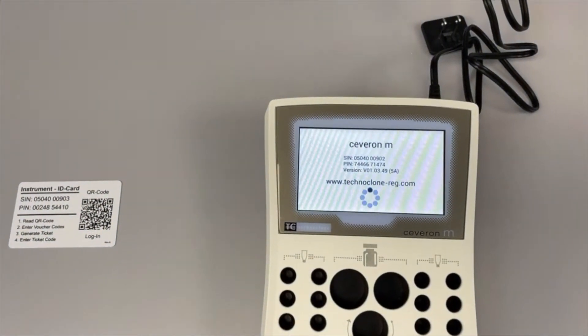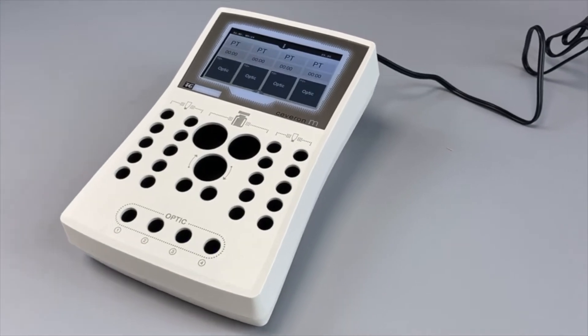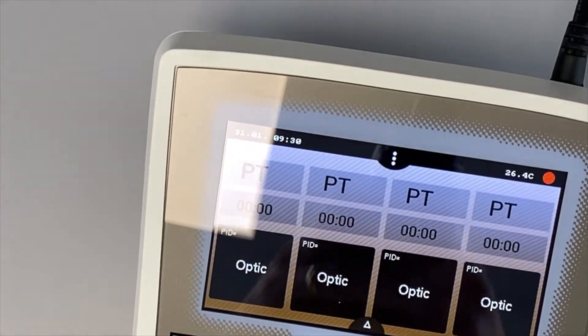After plugging the Severn M into the power socket, the instrument will start automatically. As soon as the temperature of 37 degrees is reached, you can run your samples.